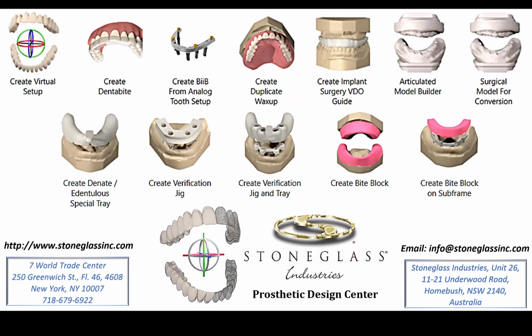And so, at its core, Stoneglass is a manufacturing and research facility that specializes in dental and medical laboratory work with an enthusiasm to partner with clinicians, universities, and teaching facilities to continue the tradition of providing high quality, innovative approaches to rehabilitating patients and participating in the educational process. The software suite is a platform that has received input from prosthodontists, surgeons, and universities and medical centers around the world. Whether you are in private practice or contributing to an academic curriculum, or both, we would welcome you as a part of our family.